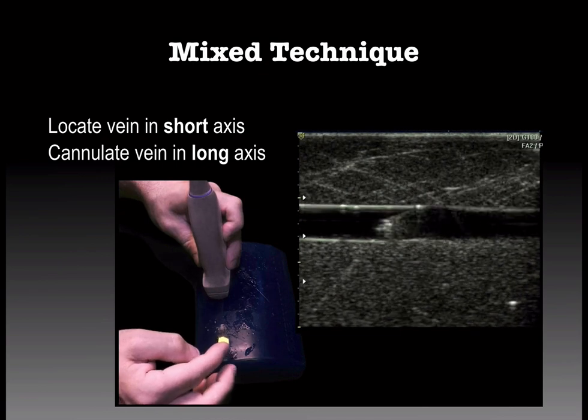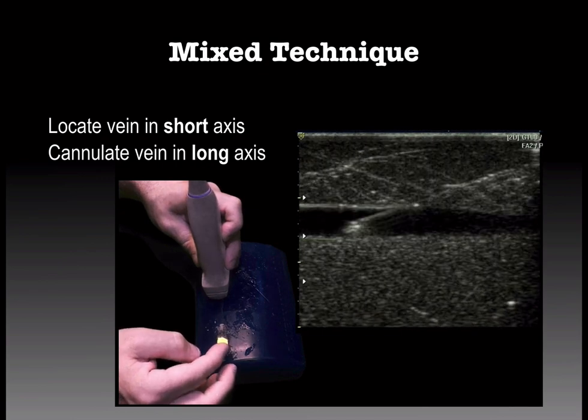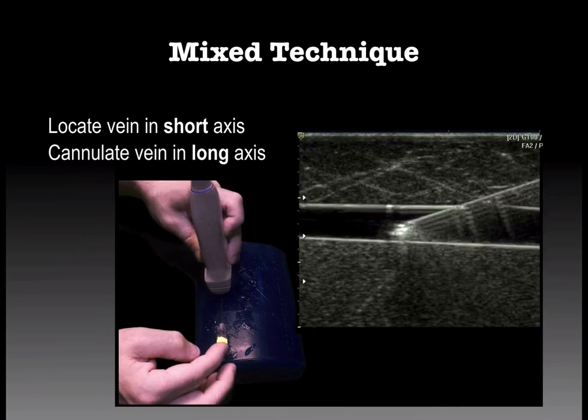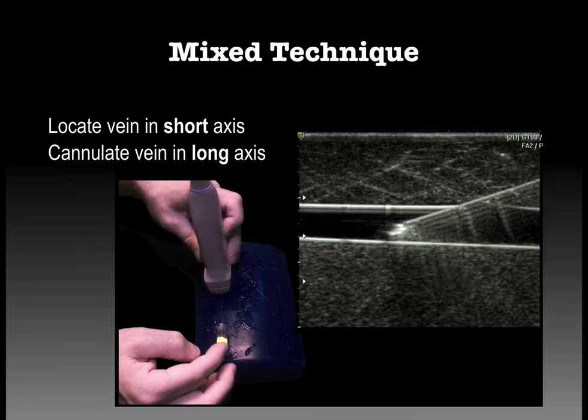Now, this technique is great for placing central lines, but what it is even better for is when you're in a short axis approach and you lose your needle tip and you're not sure exactly where you are. Instead of removing your needle and starting over, if your needle is pointing right at your vein and you know it is, then go find your needle, because generally that's easy to find, and then finish the procedure off in long axis. So this is a rescue technique.